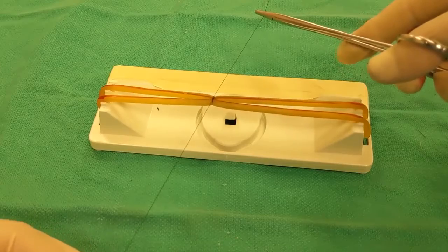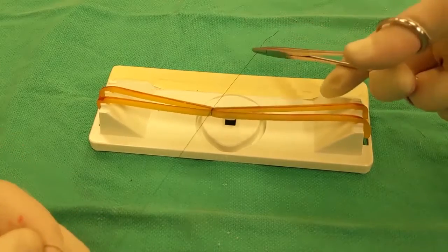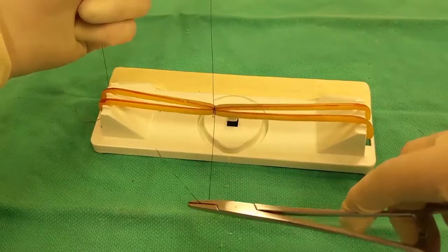As with all ligatures, a second square throw is placed to maintain your ligation, and then your first knot is secured in place with a second square knot.